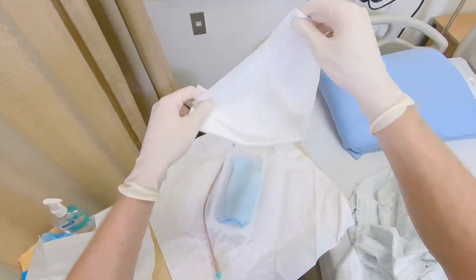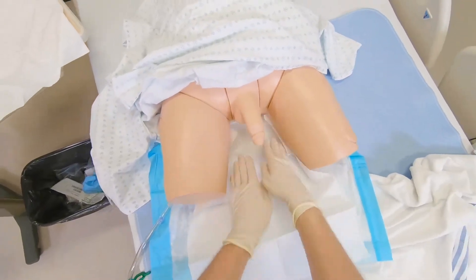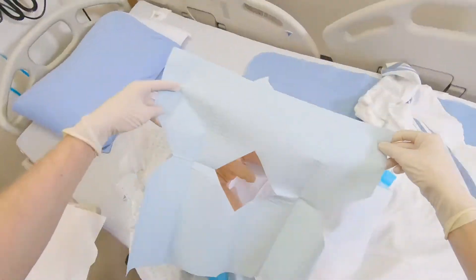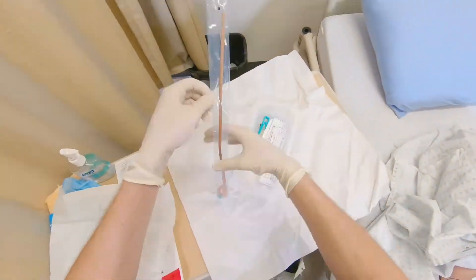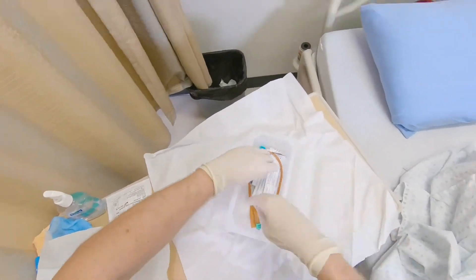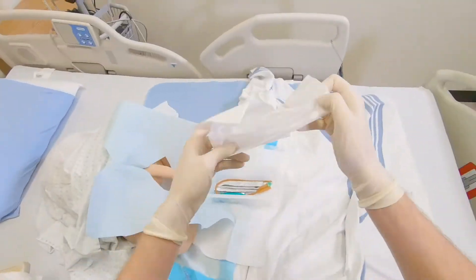Extend sterile field by placing sterile drape shiny side down under the peri area. Next, place fenestrated drape over the penis. Remove second layer of packaging from the catheter. Place the catheter kit on your extended sterile field. Set up the garbage bag.